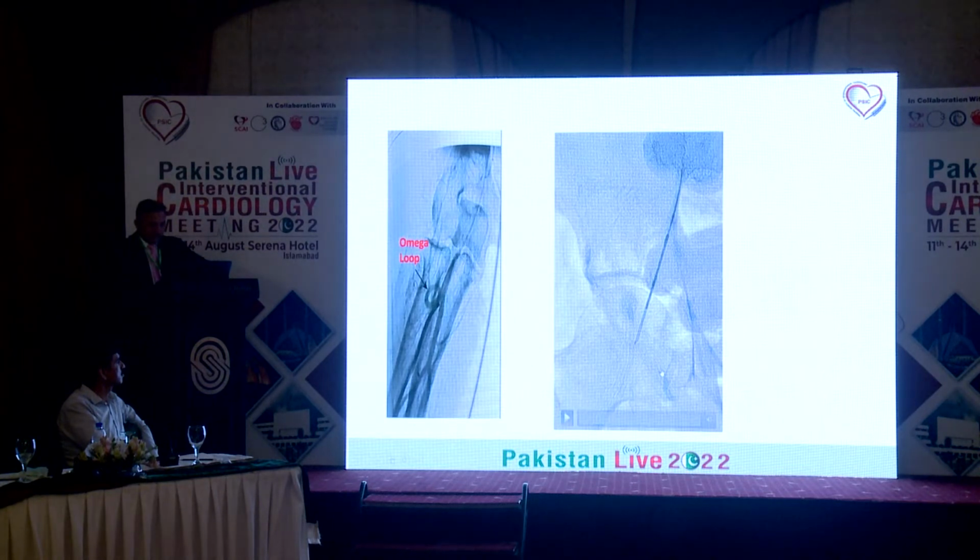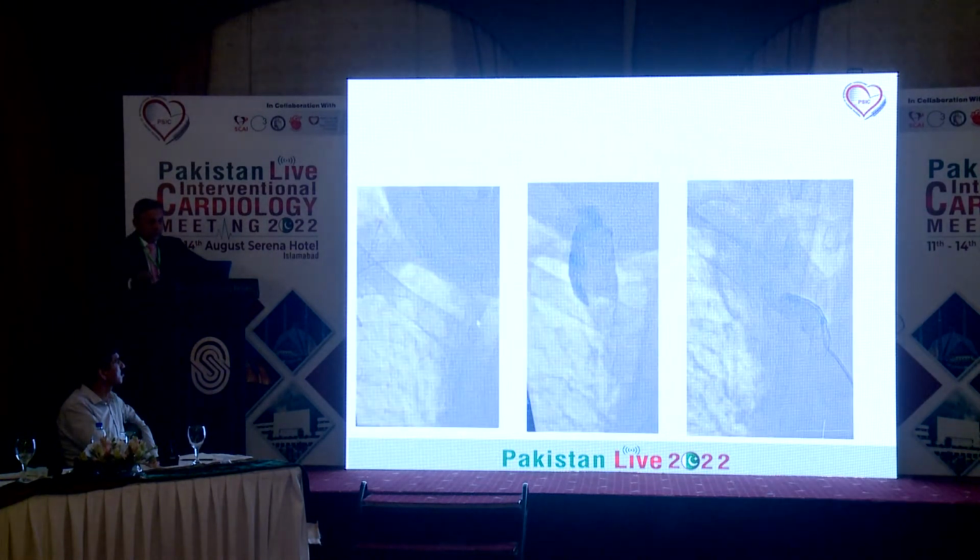I think this video is not playing. Anyhow, it was for peripheral intervention below the knee, and the puncture was antegrade because it can't be done from the radial. This was one of the cases, again, the video is not playing, in which our colleague was trying to do the radial, and there was a tortuous subclavian, and we can see there was perforation, but we did the injection from the femoral. Thank God, it was sealed. It was a small branch perforation.